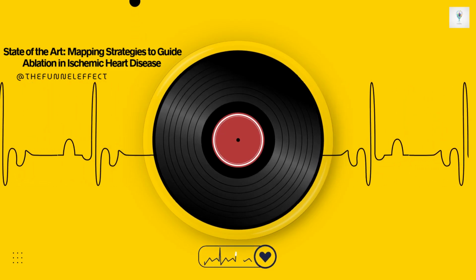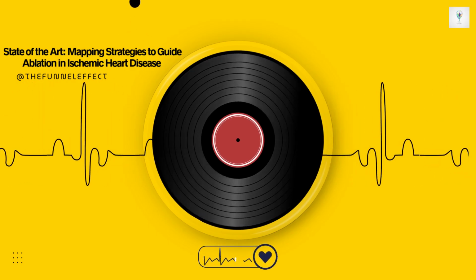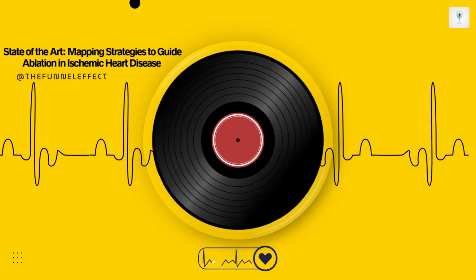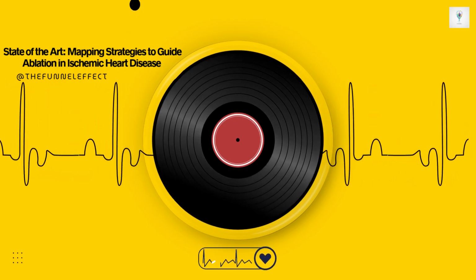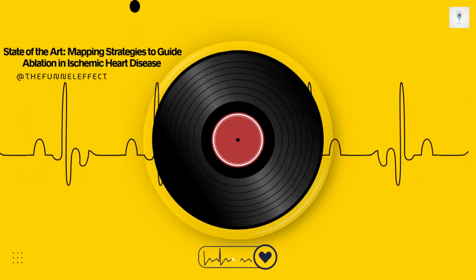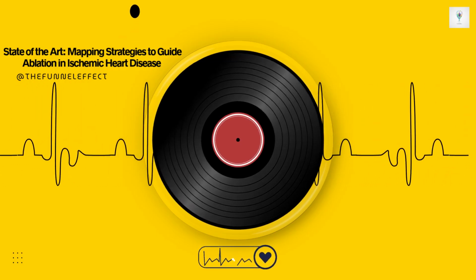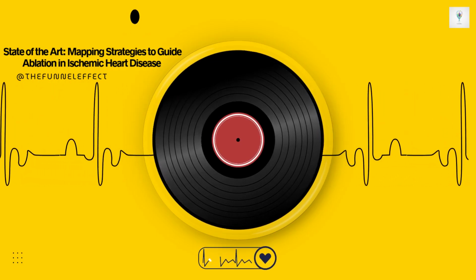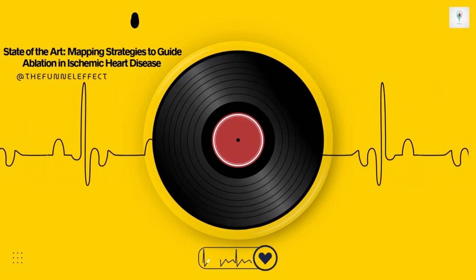So by pacing from multiple sites, typically at least one in the RV and one in the LV, you interrogate the scar from different directions. This increases the sensitivity of the ILAM technique, making sure you uncover all the potential slow zones that could possibly host a VT isthmus. All right, one more substrate mapping technique to cover. Yeah. The classic pace mapping. How do we use pacing to find the exit point of the reentry circuit?